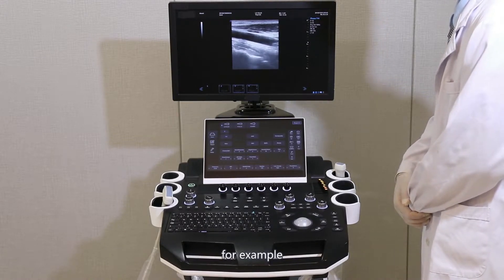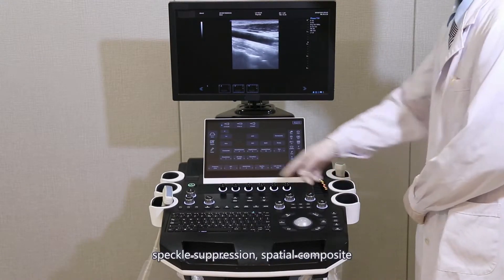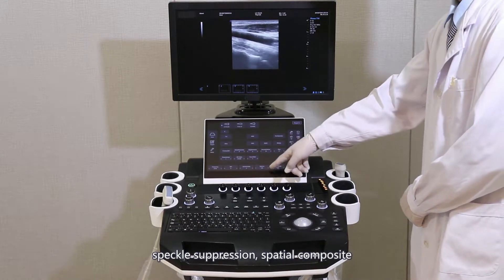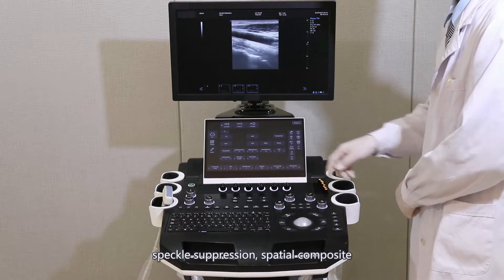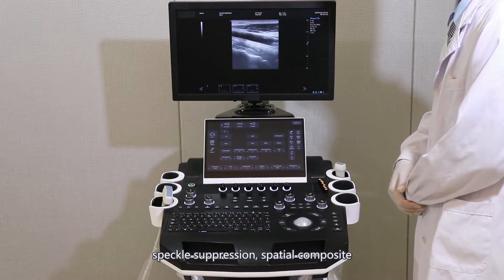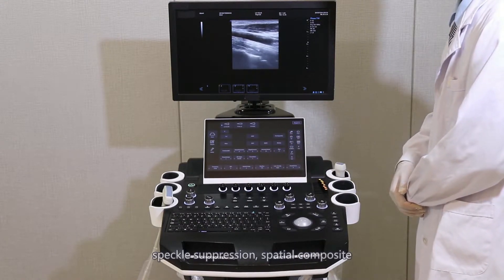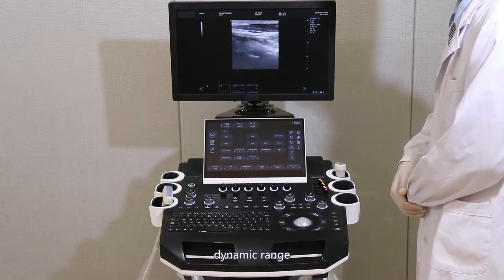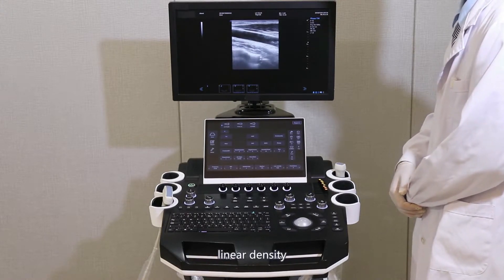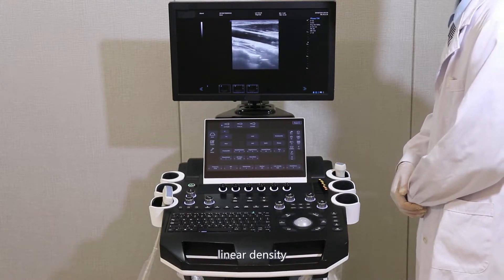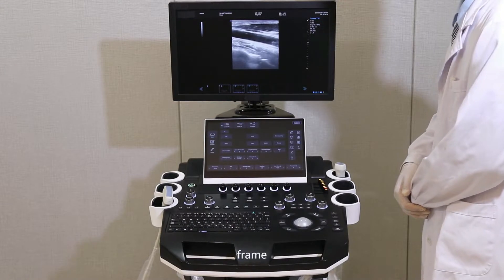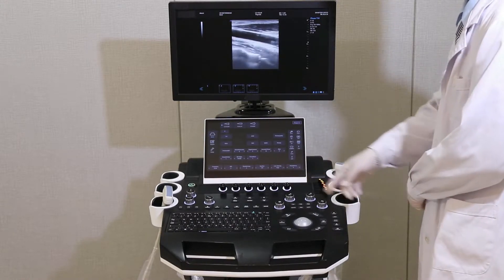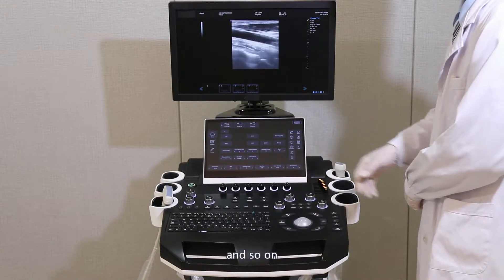For example, parameters adjustable on the touch screen include: frequency, speckle suppression, spatial composite, dynamic range, linear density, frame correlation, and so on.